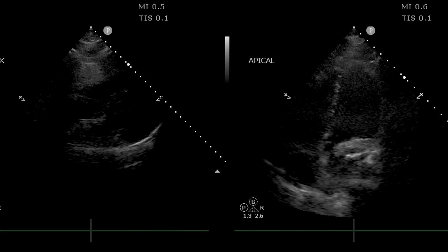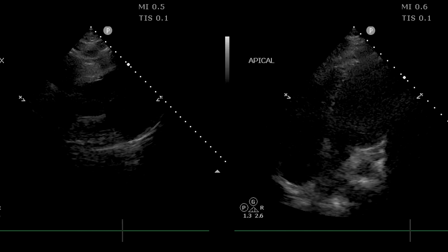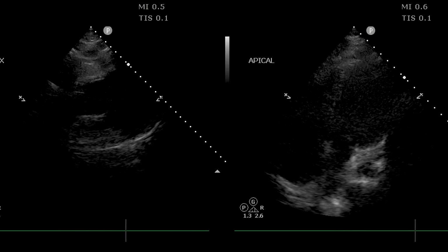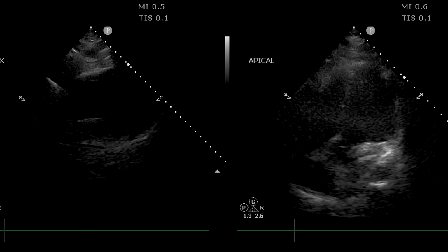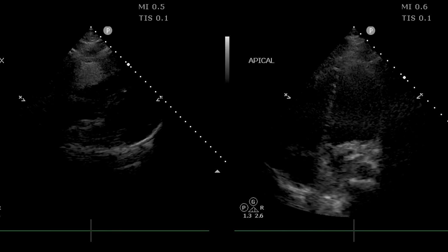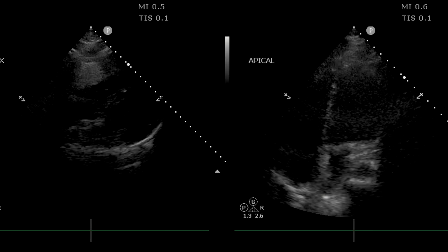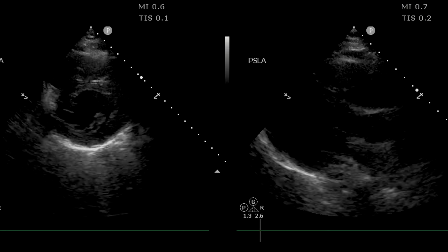trying to get your windows for your ejection fraction assessment, make sure you can actually see that endocardial border, right? So walk through this mental step or thought process in your head: do I have an adequately visualized ventricle, right? If I got it rotationally appropriate, longitudinally appropriate, is there anything overlying that? Can I see the interior diameter or interior border of that chamber? And then once I do that, is that wall thickening? Is it moving? What is the degree to which that's doing that? And that's all going to go together as you work through this mental algorithm to figure out your left ventricular ejection fraction, right? So that's that technical piece.